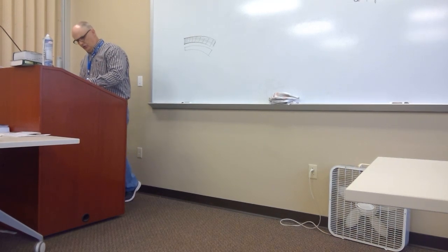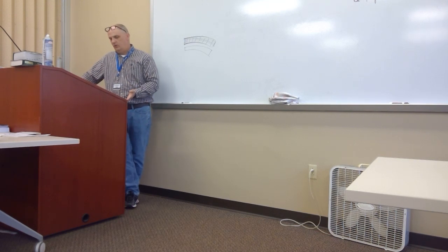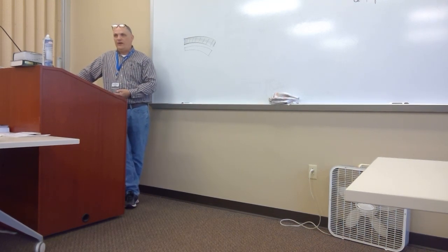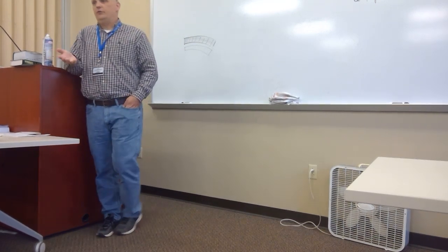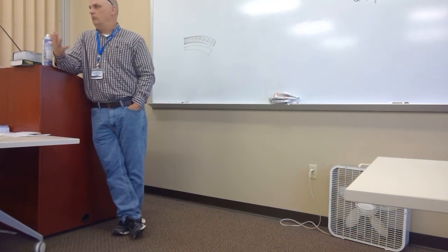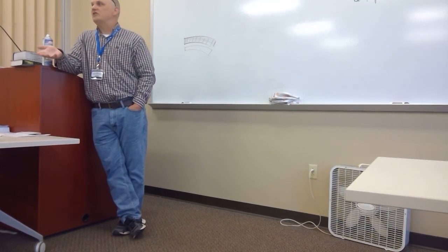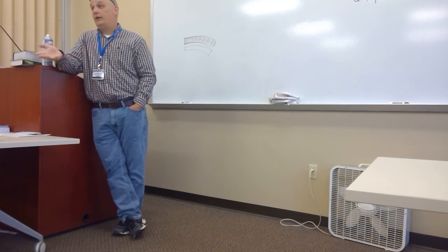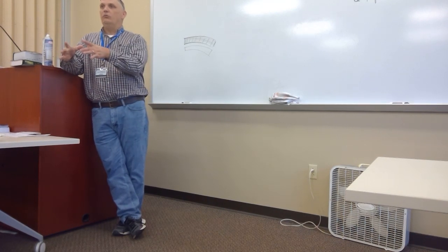Okay, specimen collection. When I was looking over this morning, I thought about that answer's an objective. There is gonna be a test question that comes from that reading about specimen collections, but I'm gonna tell you what you need to know about it, okay? Depending on what lab you work in, I may differ a little bit from the reading, but I'm telling you real world stuff about it now. Usually stool specimens are sent down, I call them like a butter bowl, all right? They'll either be in a gray container, they usually won't be see-through, okay? The ones I've got made up for you today are see-through, because I want you to get used to seeing stool specimens, all right? But they usually come in a little bowl.